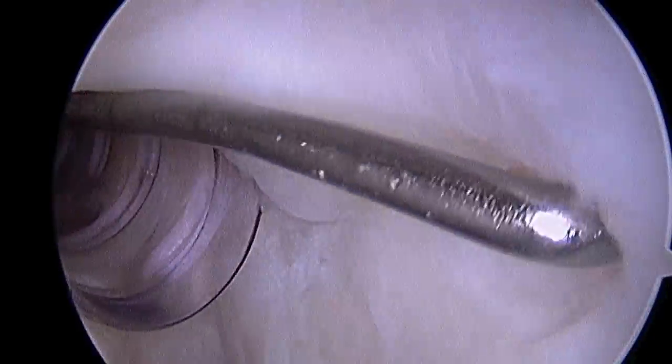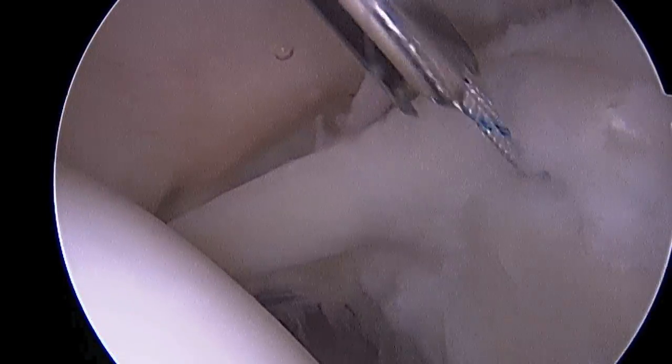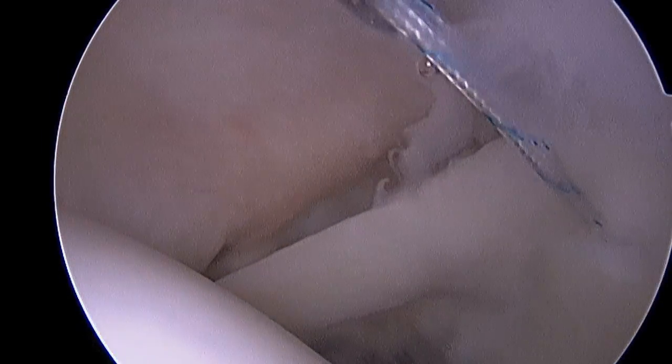Now we have to work on the posterior portion indicated there. There you see our anterior stitch once again. Now we're placing an anchor more posteriorly — there you see the guide in place and the suture anchor once implanted.